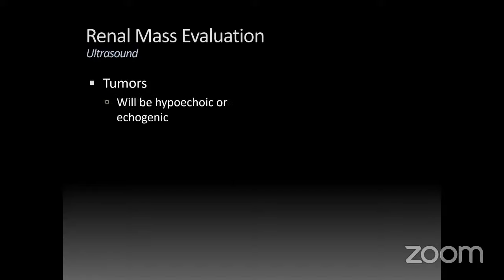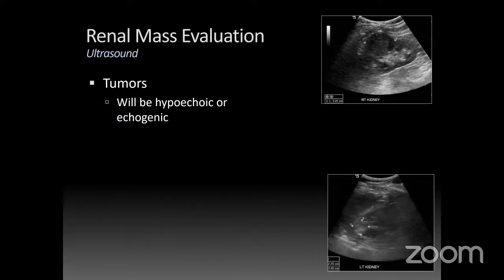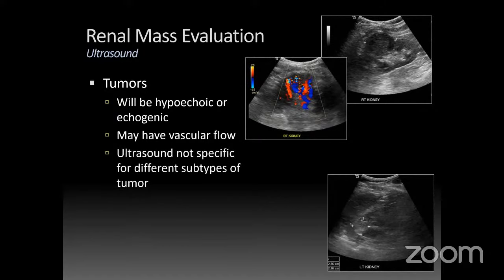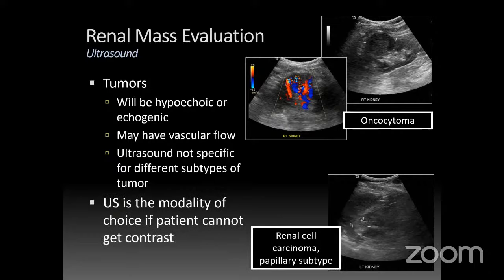For renal tumors, they can be hypoechoic or echogenic. Here's an exophytic hypoechoic mass, and here's an echogenic lesion at the upper pole. You can't really differentiate these — they might have vascular flow, but ultrasound isn't specific for different subtypes of tumor with conventional ultrasound. One turned out to be an oncocytoma and the other a papillary renal cell carcinoma. But ultrasound is a great option if the patient cannot get contrast.